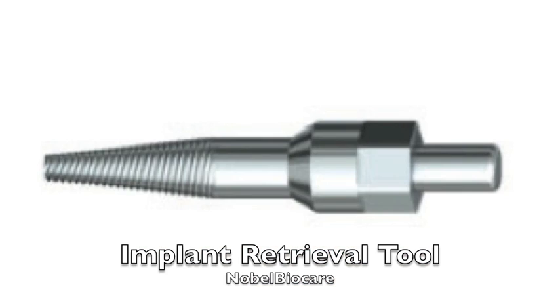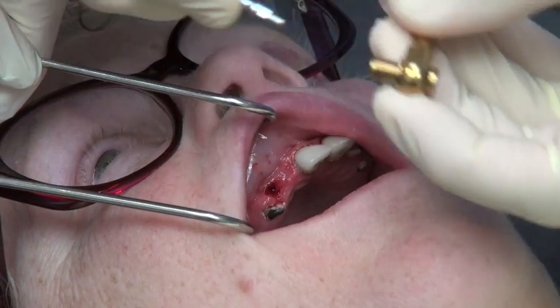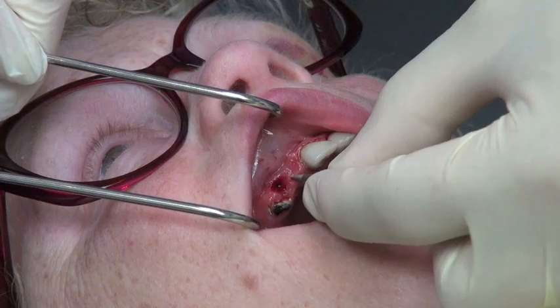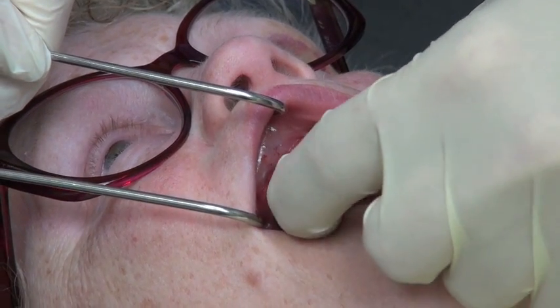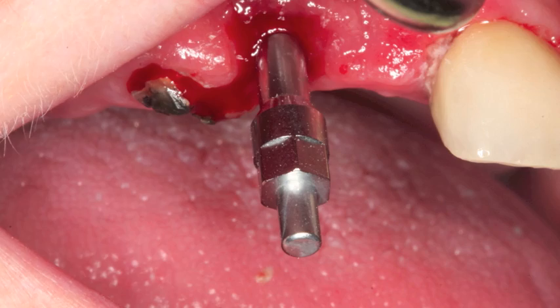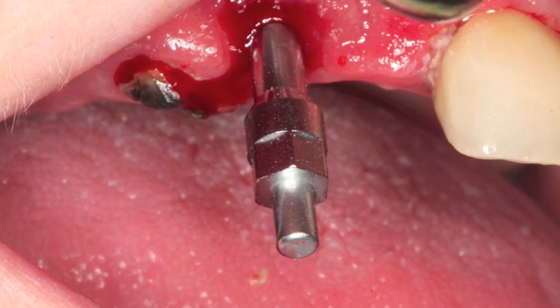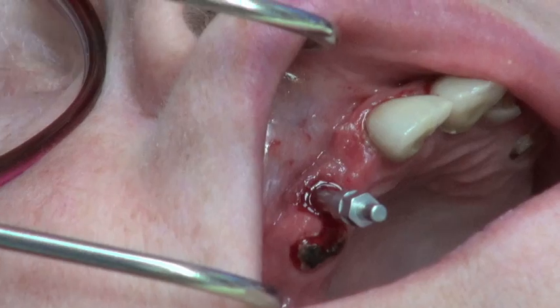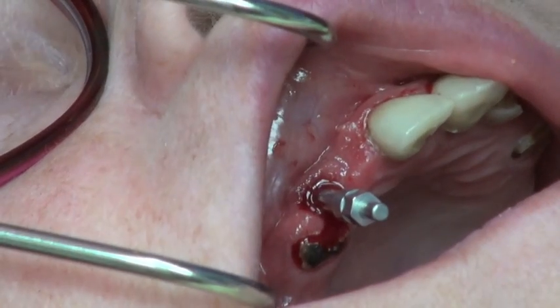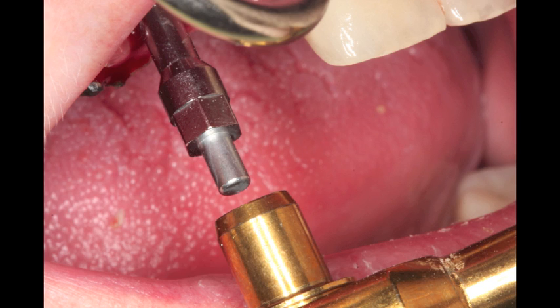We're going to take the implant retrieval tool and spin it into the implant backwards. It has a backward thread that grabs into the screw channel of the implant, enabling you to have a friction fit that is very tight, allowing you to put high torque. The more you torque this, the more it grabs into the implant. When you place it into the implant, you'll see the hex sticking out, which enables you to use your torque wrench to torque this backwards in a counter-clockwise manner to unscrew the implant.